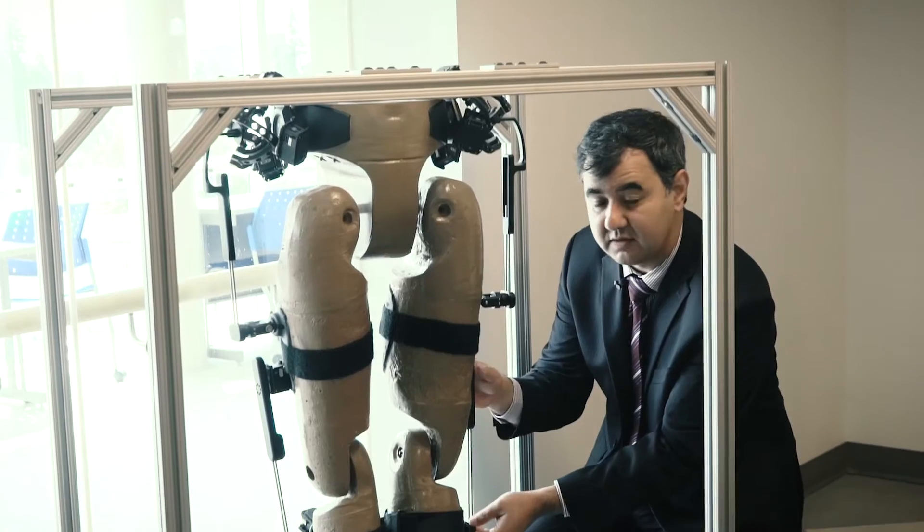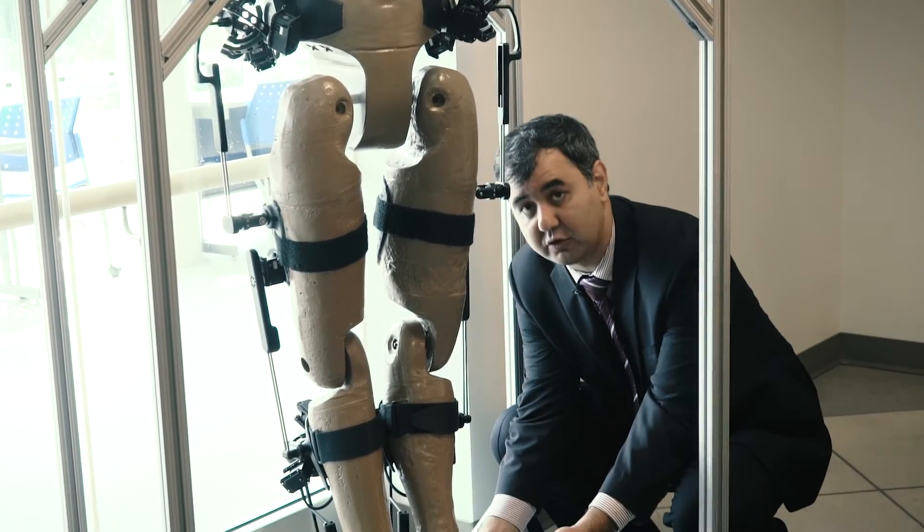One of the active projects that I am doing right now is developing a lower limb exoskeleton to help people with motion disability.